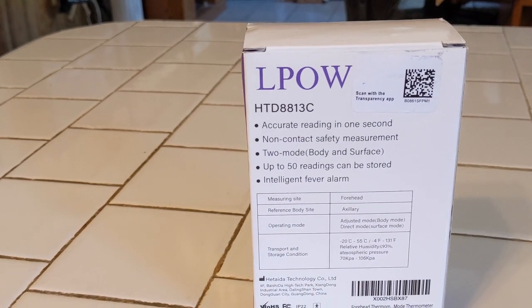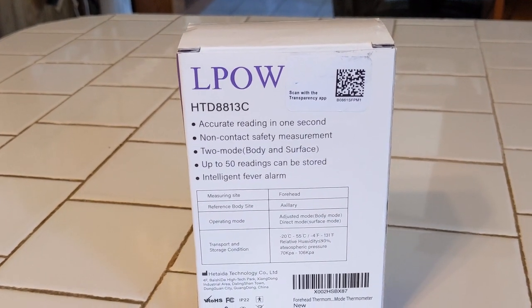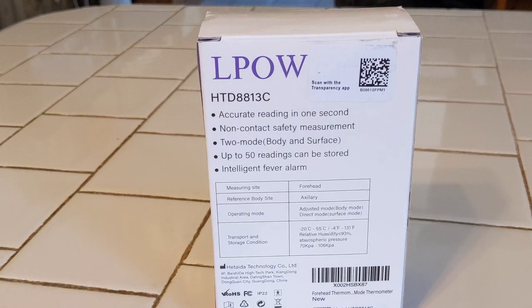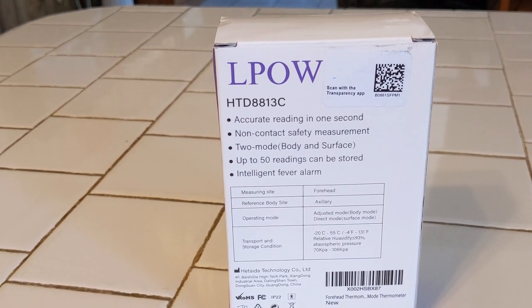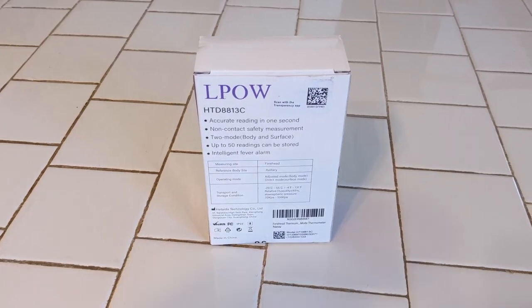It has intelligent fever alarms. It's pretty neat. We've messed around with this a little bit, but I wanted to share it with you. I don't know if you call it L-POW or L-POW, however you pronounce it, but we're going to do a little review on it today. All right, we're going to take it out of the box here.